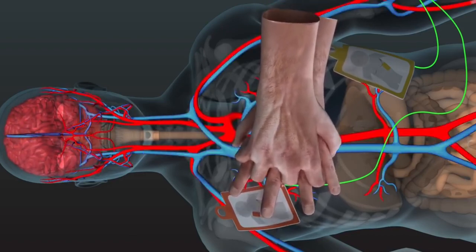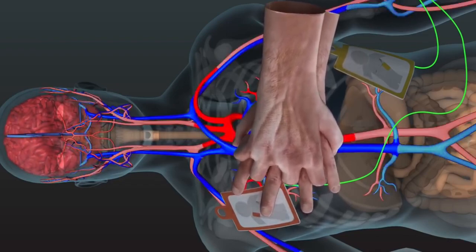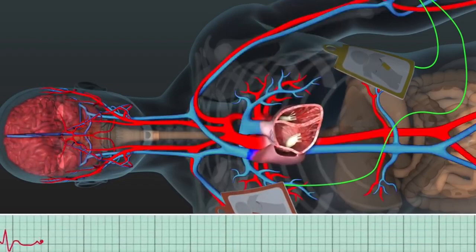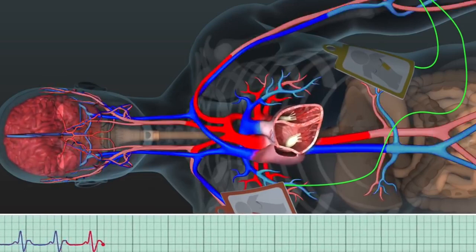After 2 minutes, the AED will instruct you to stop CPR. It will reanalyze the heart and advise whether another shock is needed. Always listen to the machine and follow the voice prompts.